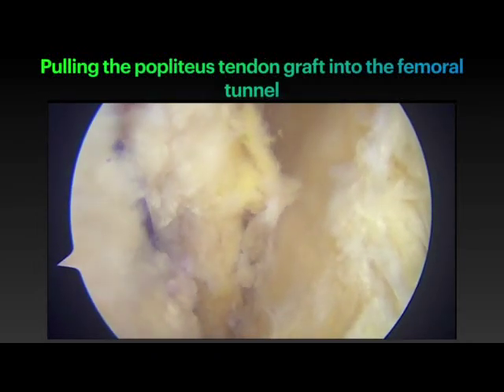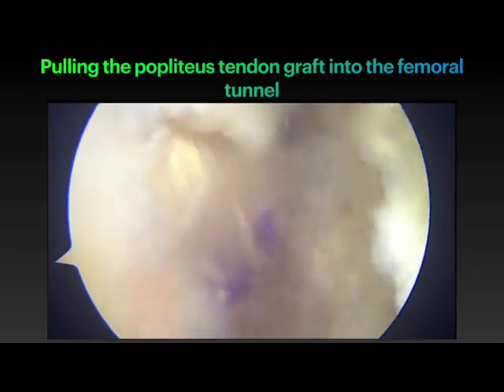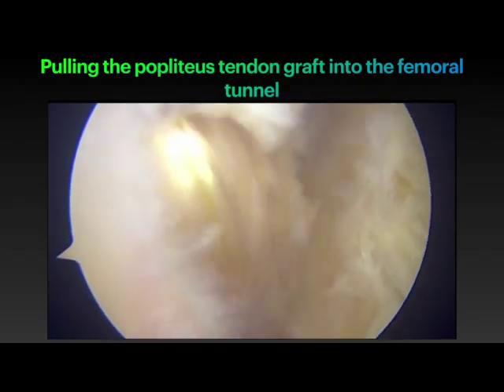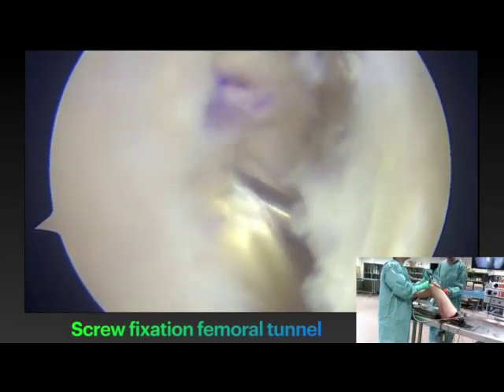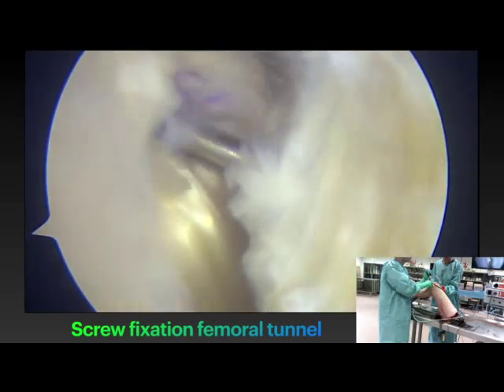Next, the popliteus tendon graft is pulled into the femoral tunnel. We aim for an ingrowth of 15 to 20 mm in both the femoral and tibial tunnel. The popliteus tendon graft is fixed into the femoral tunnel with a 7 by 20 mm bioabsorbable screw through the direct lateral portal.